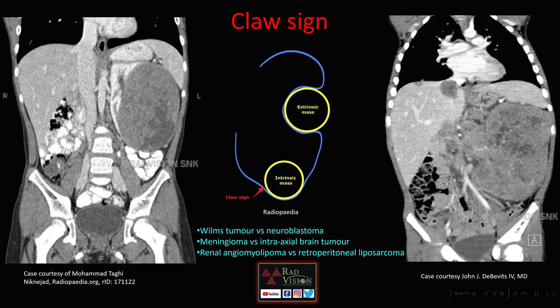Here you can see another case with a large heterogeneously enhancing mass lesion showing necrosis, extending along the left renal vein, with a tumor thrombus in the IVC and probable metastasis in the liver. These are different cases of nephroblastoma demonstrating the claw sign.